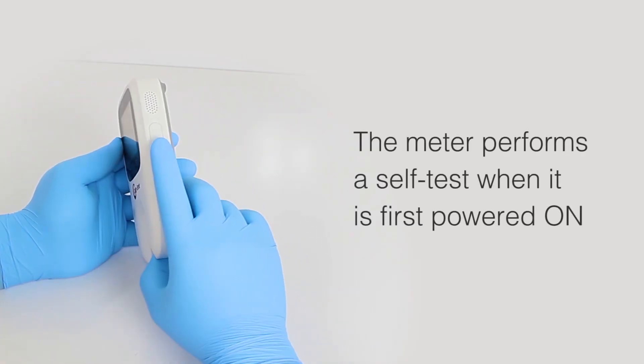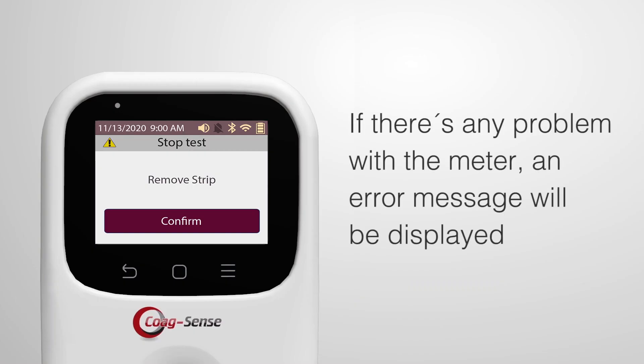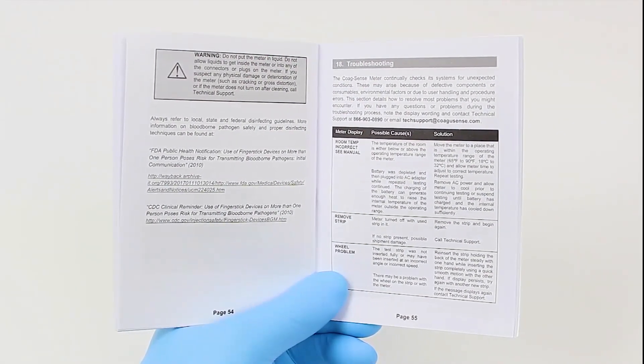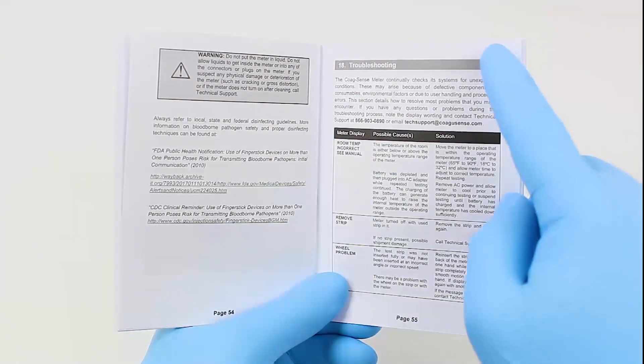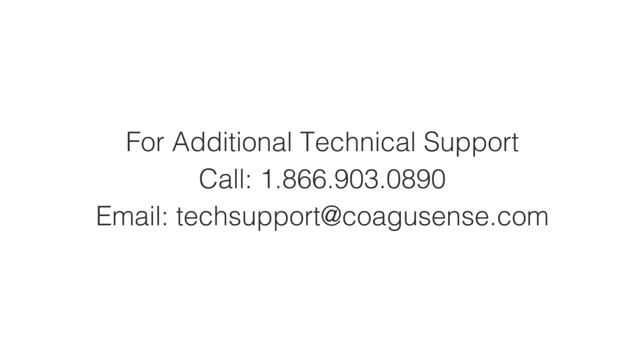The meter performs a self-test when it is first powered on. If there's any problem with the meter, an error message will be displayed. For a complete list of error messages and their troubleshooting, please refer to the troubleshooting section in the user's manual or contact technical support.